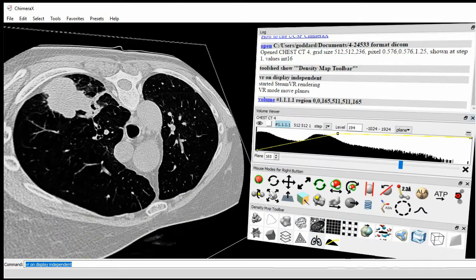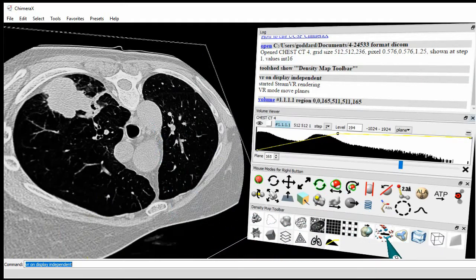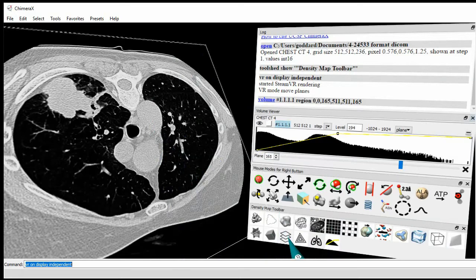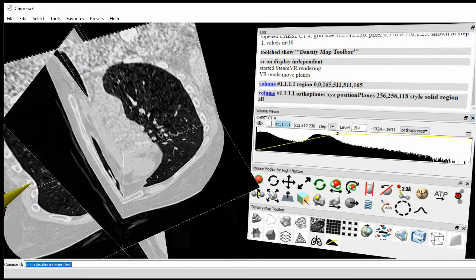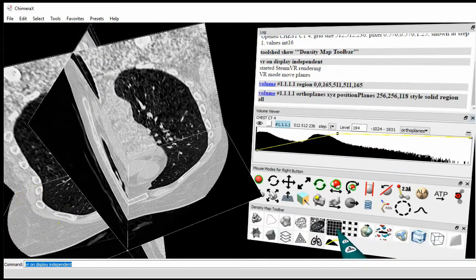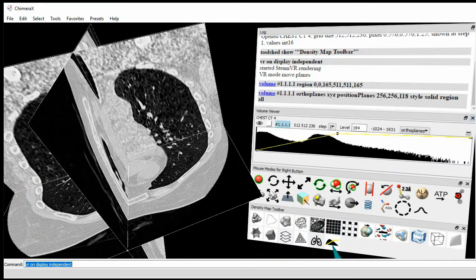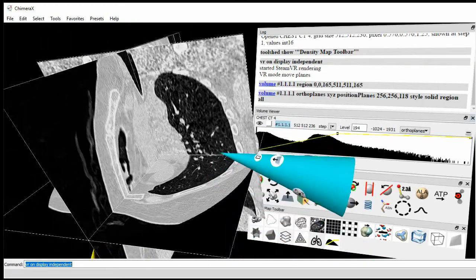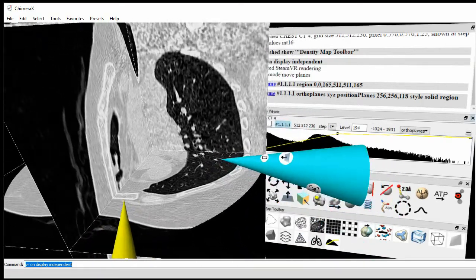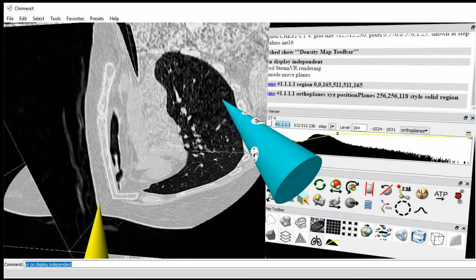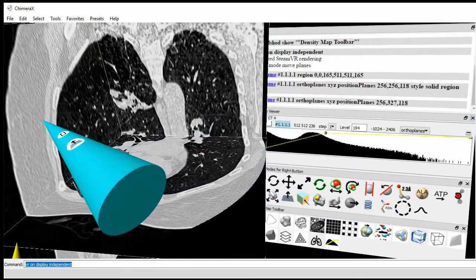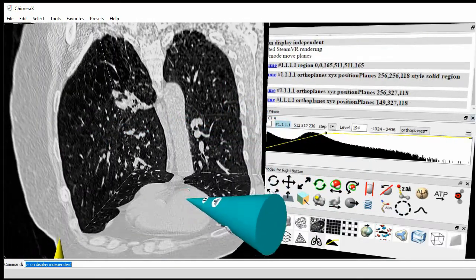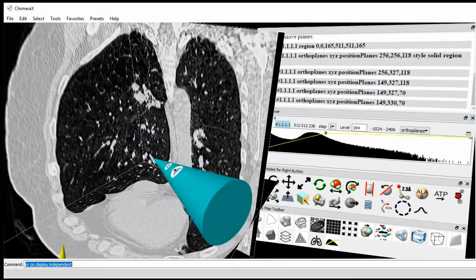For starters, how about we look at three orthogonal planes? This bottom row of icons called density map toolbar, these do particular actions. This one in the lower left-hand corner, if I click this, it will show three orthogonal planes. This bottom row of icons doesn't assign things to the buttons. They're just single actions. You can click on it with any button on the hand controller. Now that I have three orthogonal planes, I can move any of the planes with the same mode to get a view of whatever region of the lungs I want.